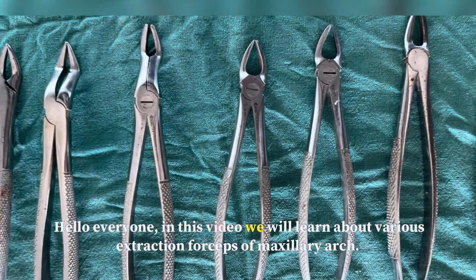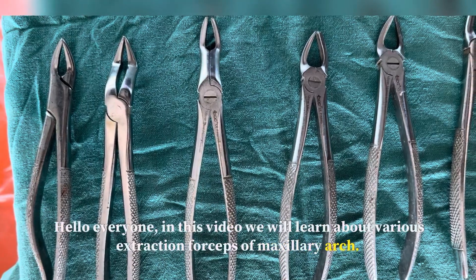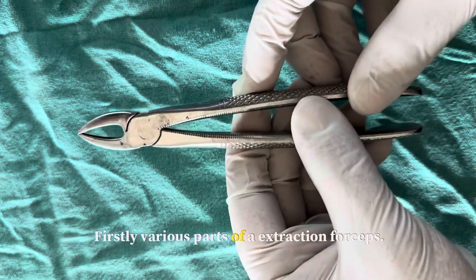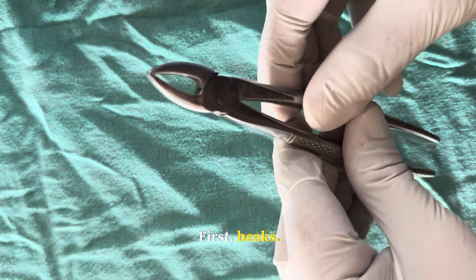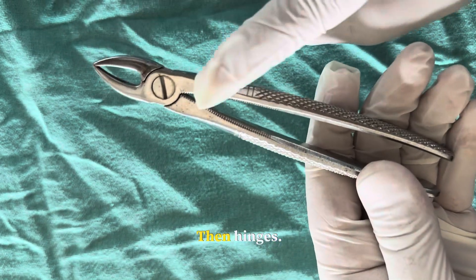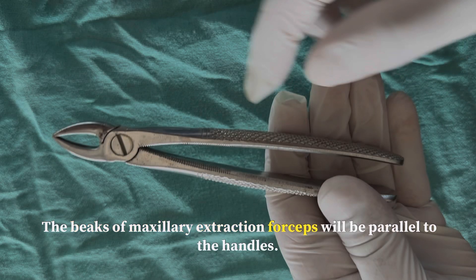Hello everyone. In this video we will learn about various extraction forceps of the maxillary arch. The various parts of an extraction forcep are: first the beaks, then the hinges, and then the handle. The beaks of maxillary extraction forceps will be parallel to the handles.